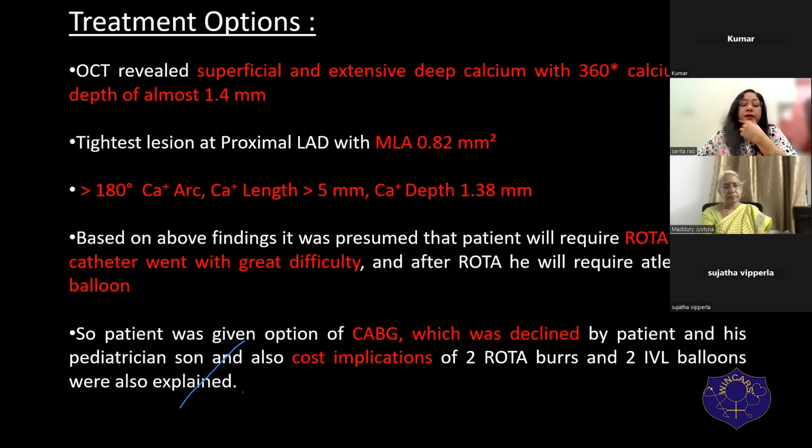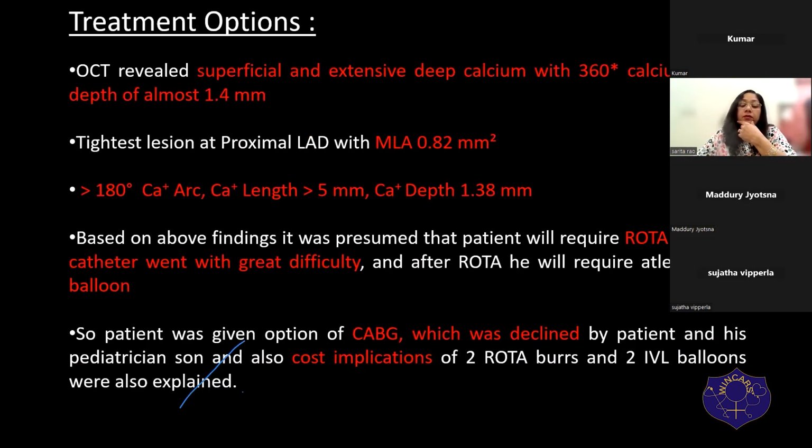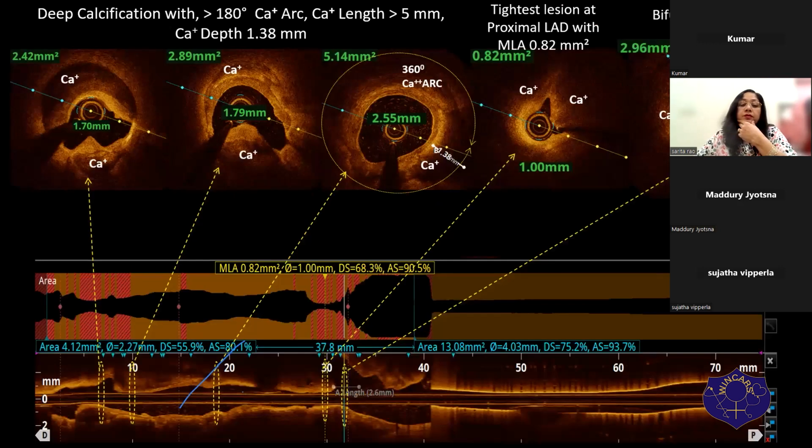So now at this point, there is a question, Sarita, whether you balloon dilated before passing OCT. Whether I balloon dilated before passing the OCT. Actually, I did this case about 3 months ago. No, madam, I think I went straight in. I said, let me try. If it goes, fine. If not, I'll balloon dilate and try to go in. So it entered with a little difficulty. It gave me difficulty in going in, but it went.